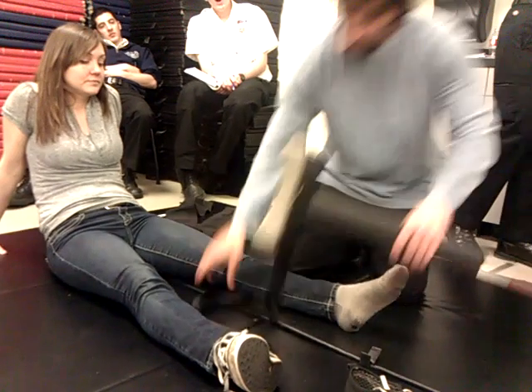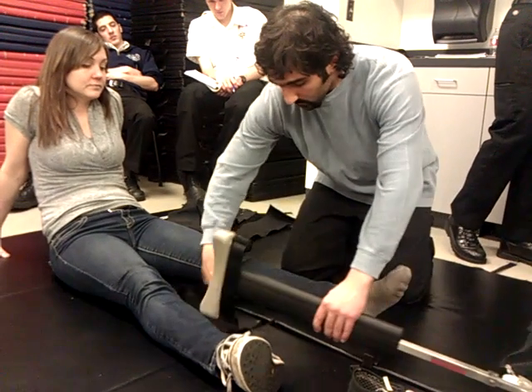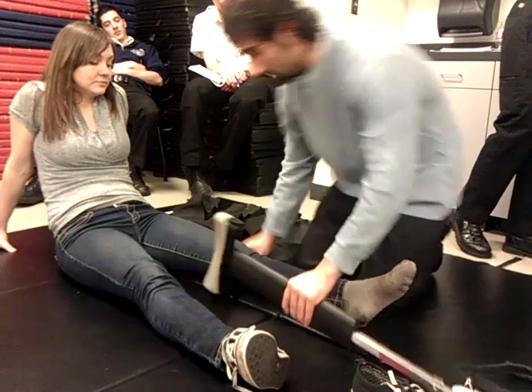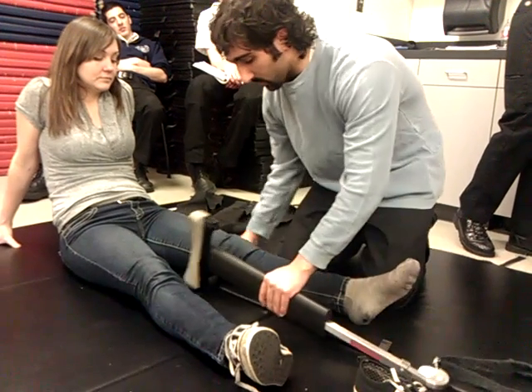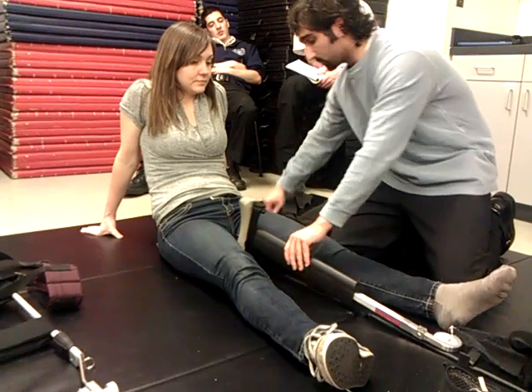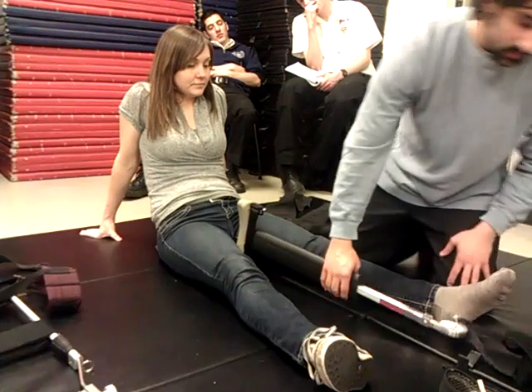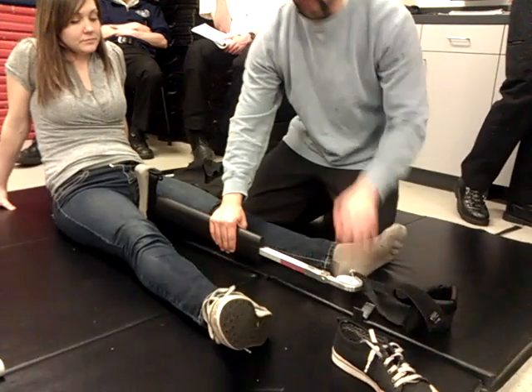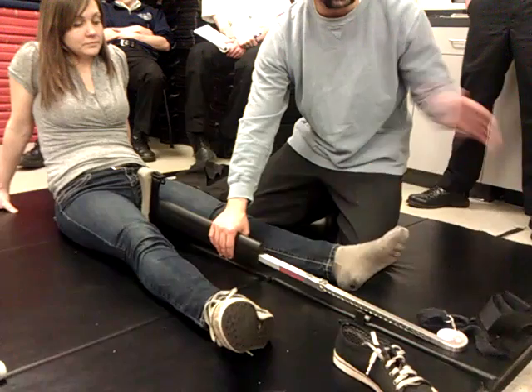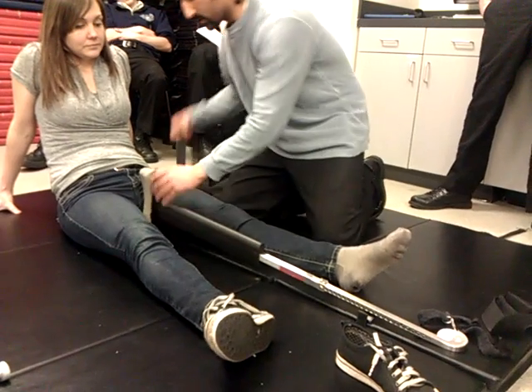Right. So you're going to slide this into place. And same thing for this, you're going to have an ischial strap that you want to secure up as high as possible. So in order to do that, you're going to be sliding it almost all the way up there. And if they have a shorter leg or a longer leg, and the device is going to hit the ankle, go ahead and stop about 6 inches or so short, just to avoid hitting the ankle until you're ready. Then you're going to start securing the strap.